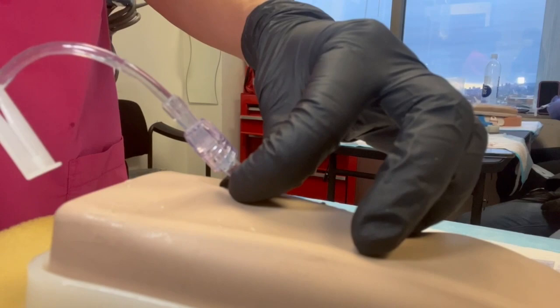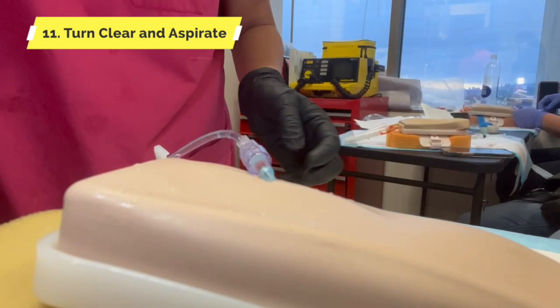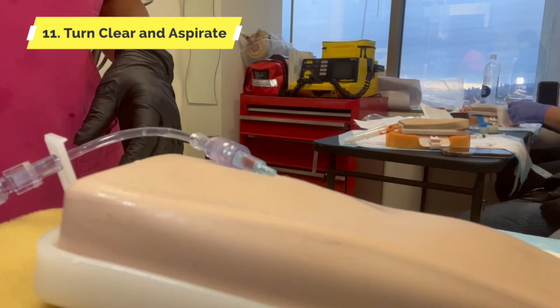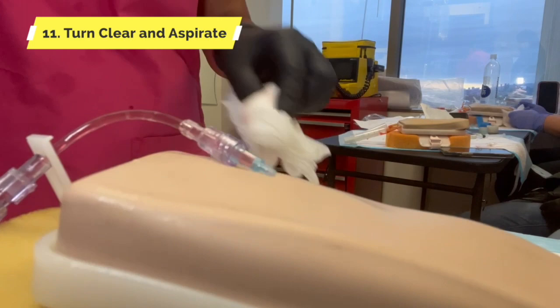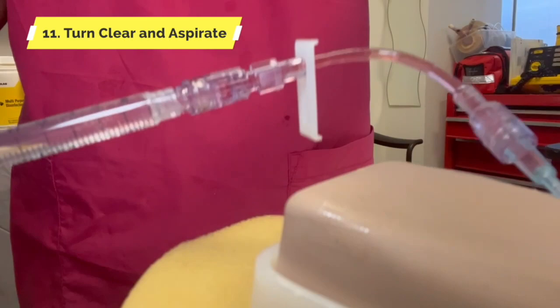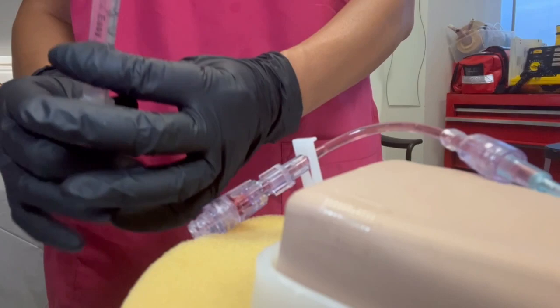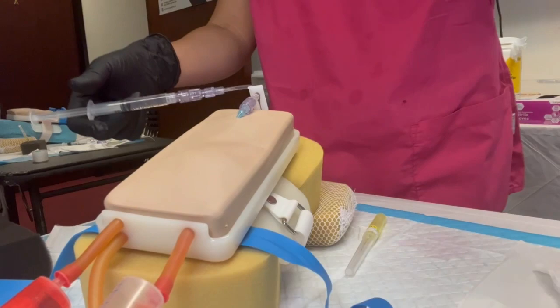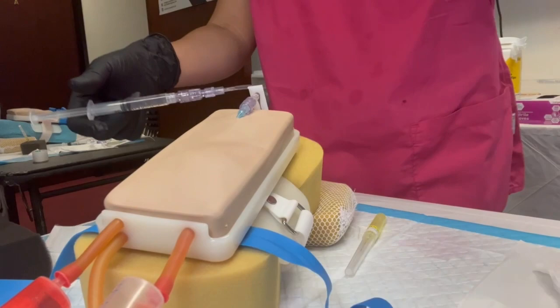Turn only the clear — it's gonna be a problem if you turn the hub. Ta-da! What do we do next? Gently — do we push it in or aspirate? We aspirate to make sure we have lovely blood, which means you're still in the vein. Do we push it now? We remove the syringe, make it vertical, and then we can flush it. That's how you connect the saline lock. It should look like this — nothing should be out. All of the cannula should be fully in — 100 percent.